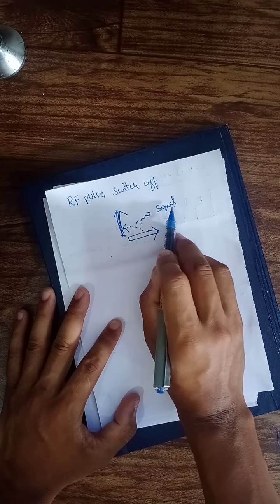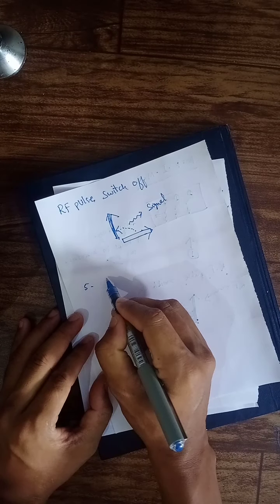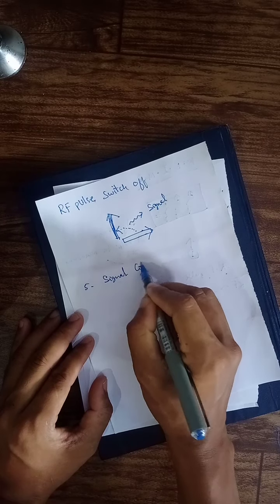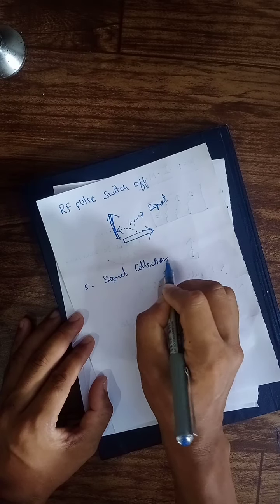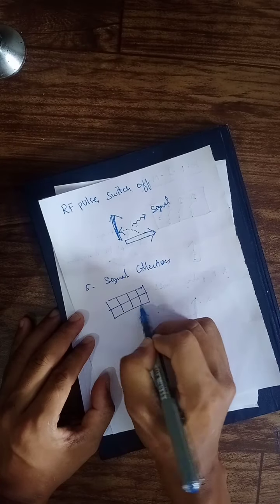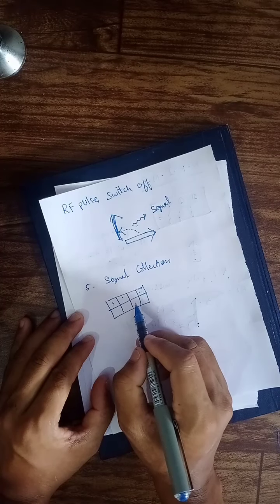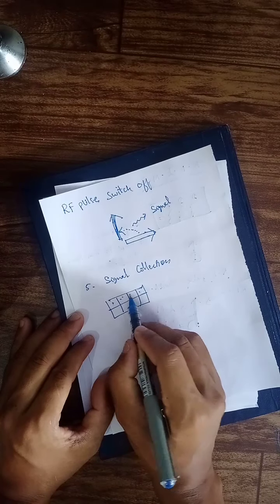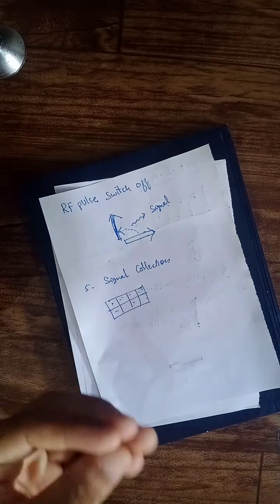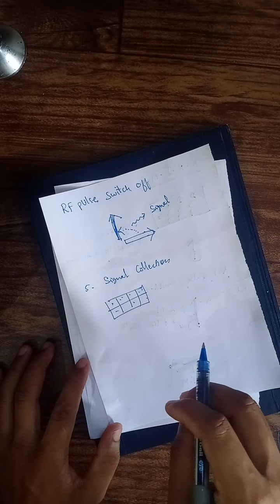I repeat, in between, it passes the signal. And remember the final step, the fifth one, signal collection. Yeah, this is how it happens. This signal will be collected by this K space. Here the signals will be collected, and this collected signal will help you to form an image.